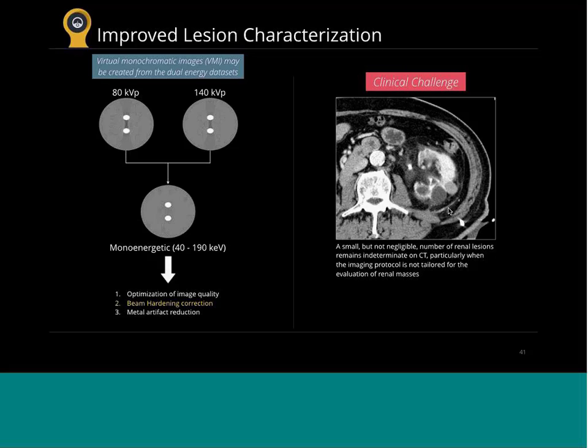And so now the radiologist is left to say, well, if I don't have any prior exams, I don't know what this lesion is, and I'm worried because it shows high attenuation, 40, 50 attenuation. Maybe it's an RCC, and they wouldn't be wrong by calling it an RCC. And therefore this exam has generated what happens all the time in radiology, which is you see an incidental finding and you've got to do something else. So this now requires either an ultrasound or an MRI.